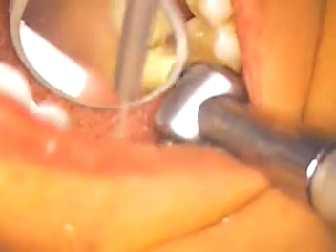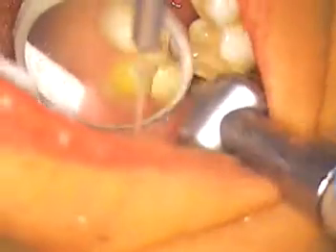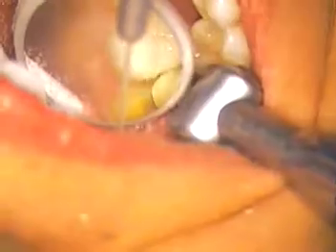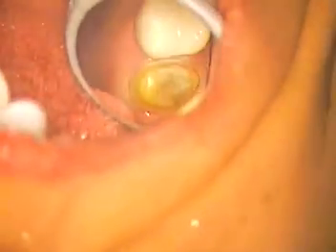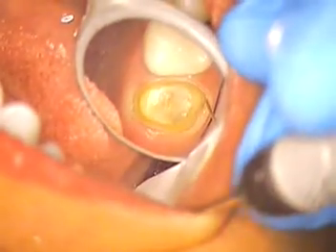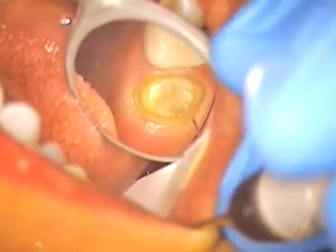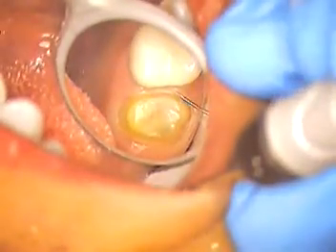Water on the tooth. I just rubber cup everything with a Centrix rubber cup. Get rid of all the sharp line angles. This way when the tooth is scanned, it really turns out great. All right, just about ready. Now I'm gonna double check her margins. Yeah. So we're right at the sulcus. That's where we wanna be.